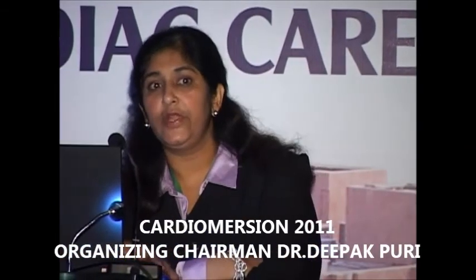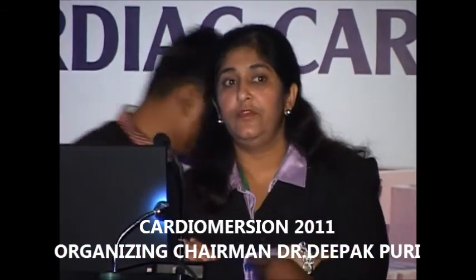Yeah, that's an excellent point that you've made. We encountered such situations, and in fact, unfortunately, we have one case where the patient was taken to the OR and nothing was found. But luckily for the patient, they did TEE prior to the surgery, so we were able to figure out that there was no aortic dissection. That is why in our hospital, because we are trying to balance the radiation dose, we have omitted the pre-contrast CT, and we now do gated cardiac CT for every patient who has suspected aortic dissection.